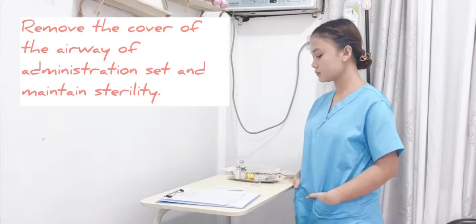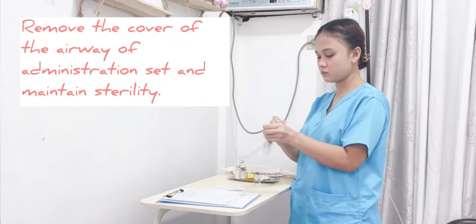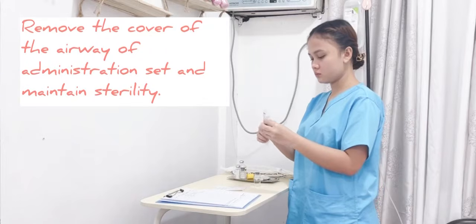Okay po. Then remove the cover of the airway of administration set and maintain sterility.